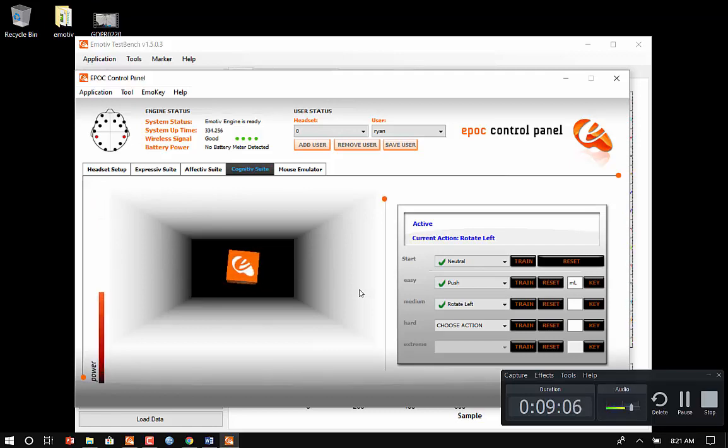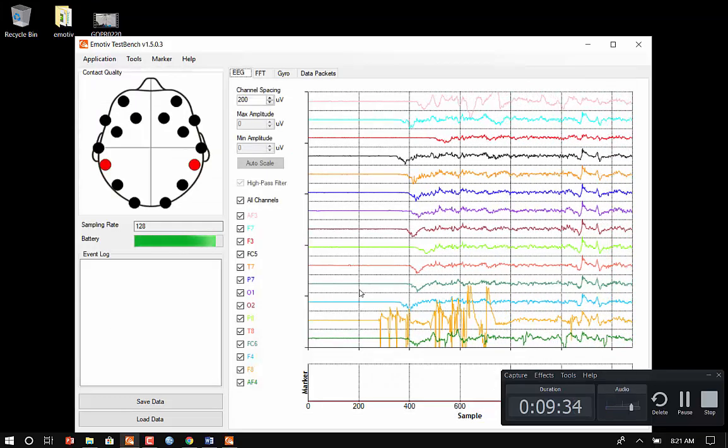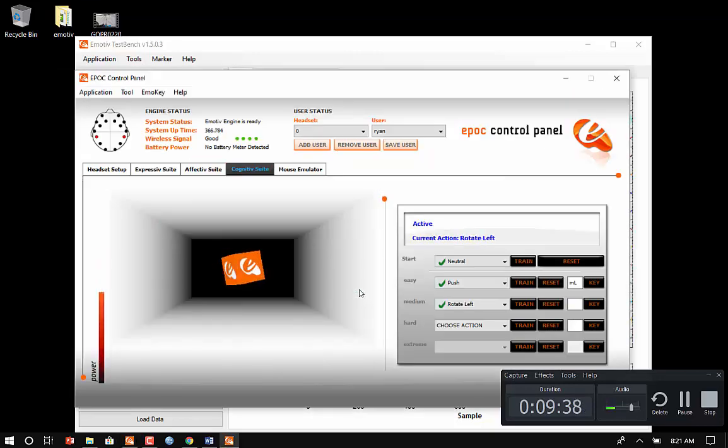Think about pushing. Okay, so now, this is where it gets tricky. Here, stand up again. Here, sit around. You can sit, so you can see this. So notice when he's moving around, it said signal is noisy. Okay, so let's wait a second for it to collect back up here. Wait for it. There you go, almost. Look at your brain. All right. Okay, we're back.